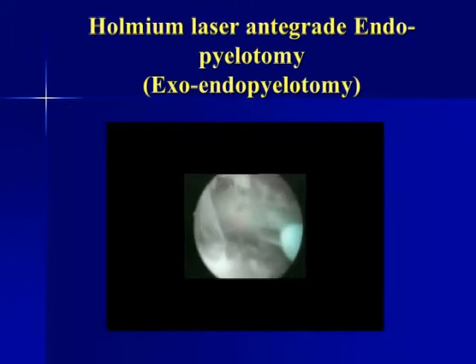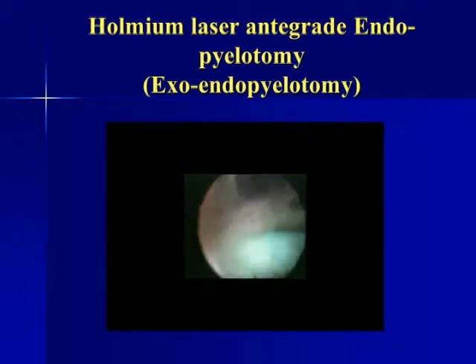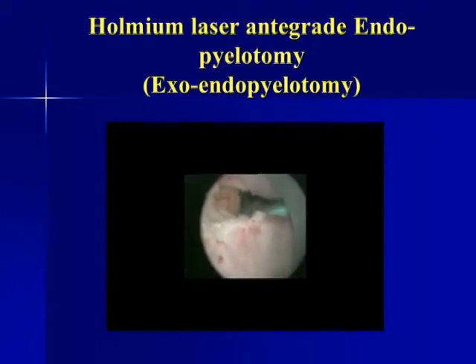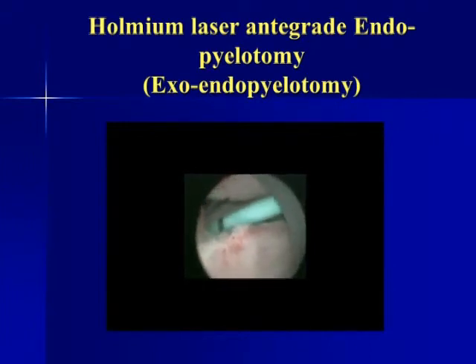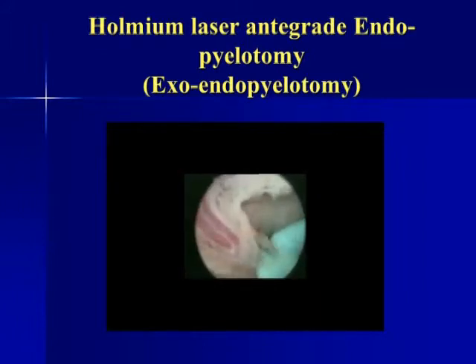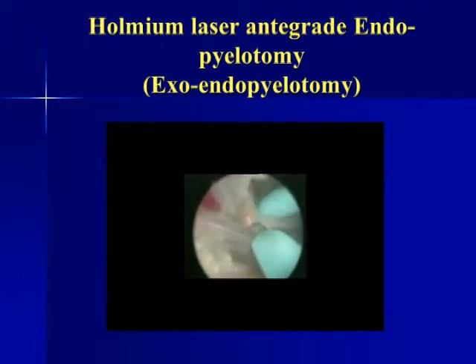What we do is exo-endopyelotomy. We cut the pelvis first, go out into the retroperitoneum, see the ureter from outside and cut the wall of the ureter from outside. This is the way we safeguard against damaging any crossing vessel and causing any major complications. We can see the vessel here, we can stay away from it and just cut the ureter from outside in.